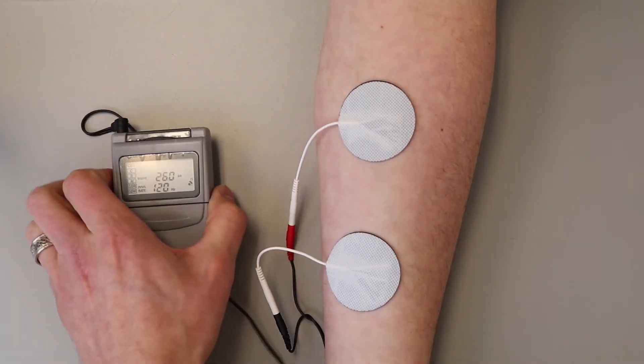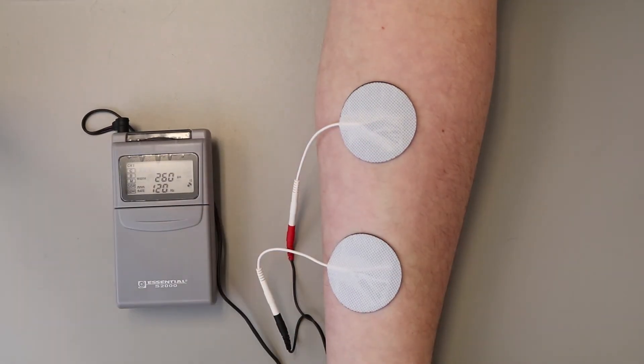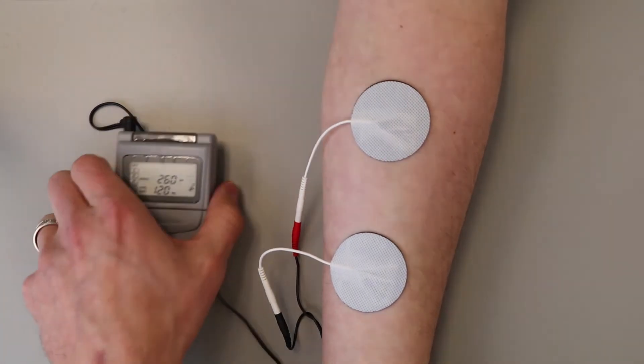The duration of your treatment should be set by your doctor or therapist. So now all you need to do is relax.